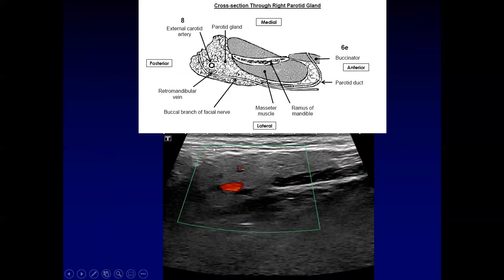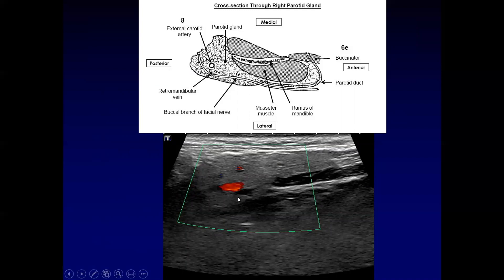This is a typical picture of a nice homogeneously echogenic parotid gland. You can see the masseter muscle coming under here, and then posteriorly you can see the division confirmed as part of the external carotid artery by the color Doppler. The facial nerve would be in that immediate area, and anatomically the identification of the external carotid artery with color Doppler would confirm the location of the nerve.